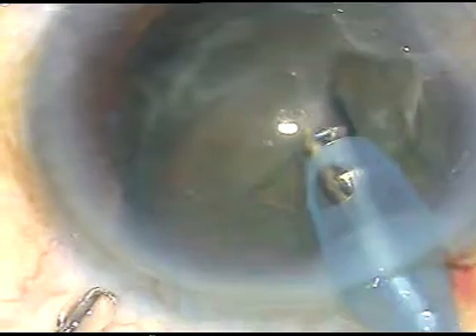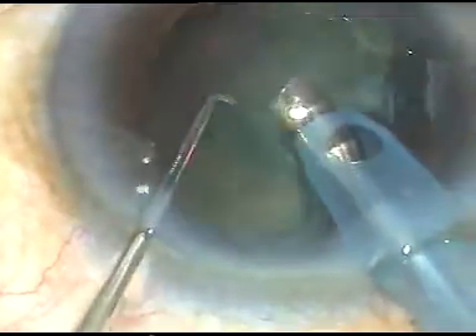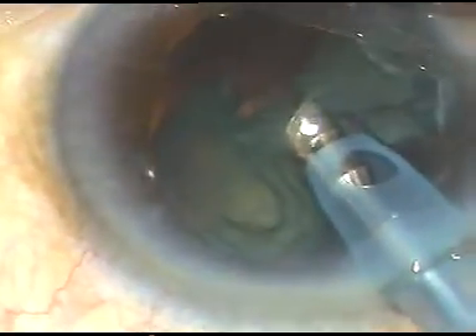I hold this nucleus — see what I am doing. I am piercing through the nuclear mass just a distance of about 3 to 4 millimeters away from the equator. A portion of the nucleus has been emulsified and taken out. Now I work on the rest of the nucleus. The equator that is towards the posterior capsule is actually protecting the posterior capsule. It is a very safe procedure.